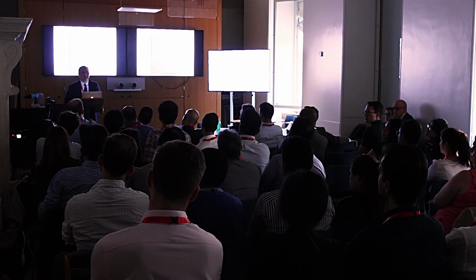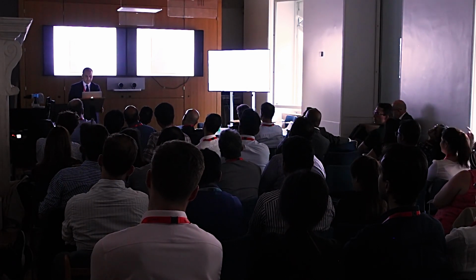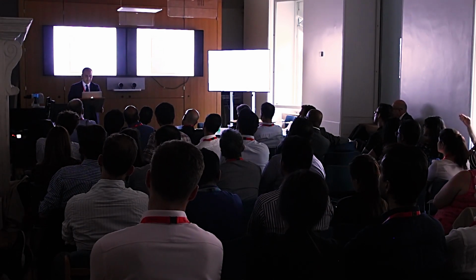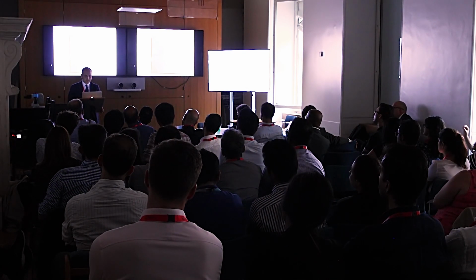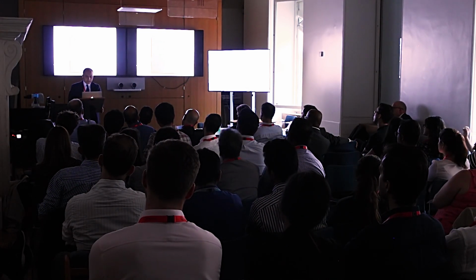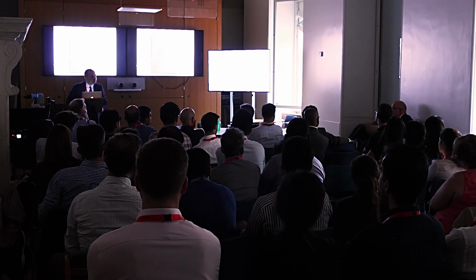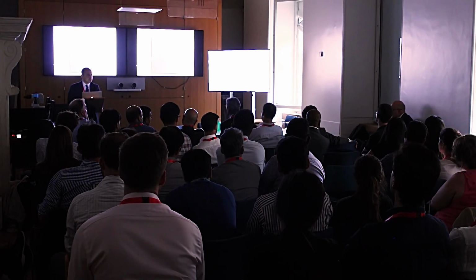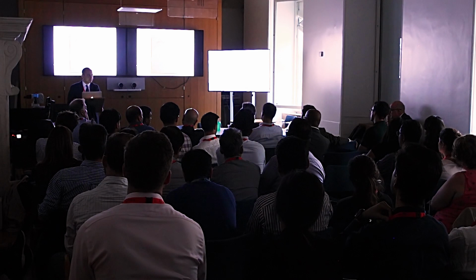Presumably, if you've still got a significant waist, then you've got, in all certainty, a 270-degree arc of calcium or more. So it should therefore be amenable to IVL as long as you can deliver the balloon. Right. That's a good option. I think you can upsize your burr, and if you're worried about the dissection, you can take another guide from an alternative access point, go from the leg for an 8 French guide in ping pong.